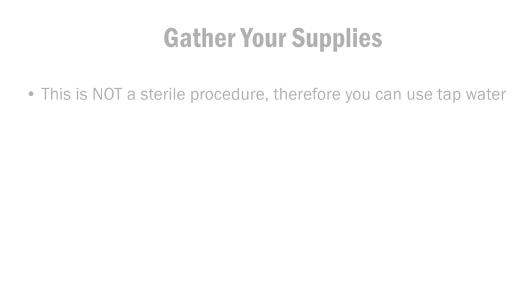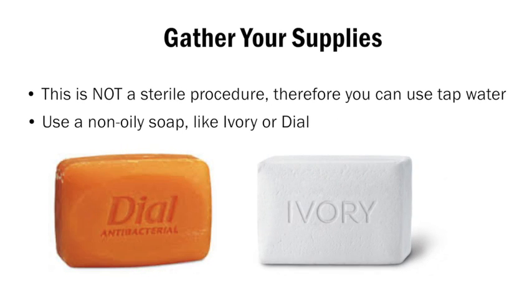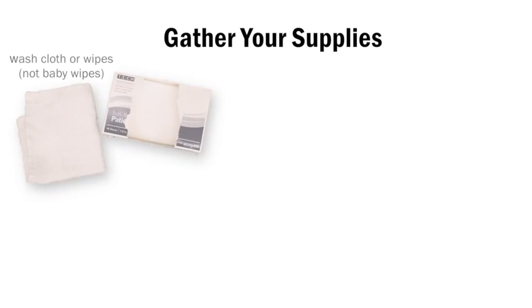You always want to make sure you have all your supplies available before you start your appliance change. This will make the change less stressful and help it to be completed in a timely way. This is not a sterile procedure, therefore you can use tap water, non-oily soap such as Ivory or Dial bar soap. You will also need a washcloth or dry wipes, not baby wipes, as they can interfere with the adherence of the skin barrier or flange.